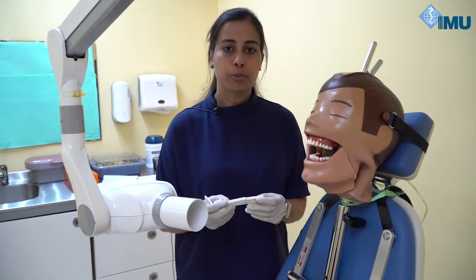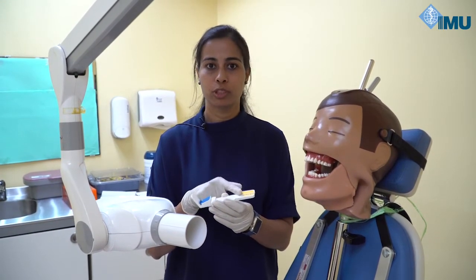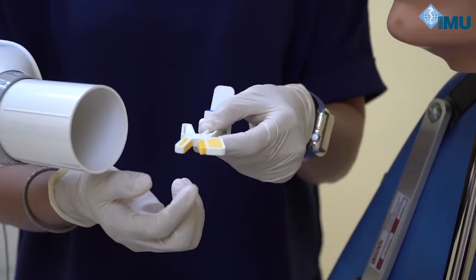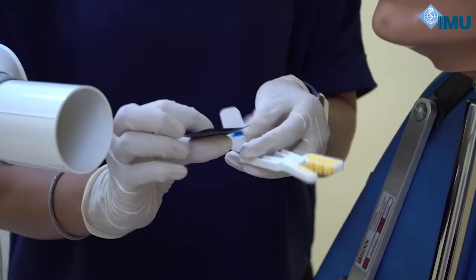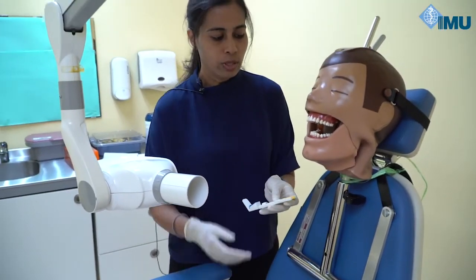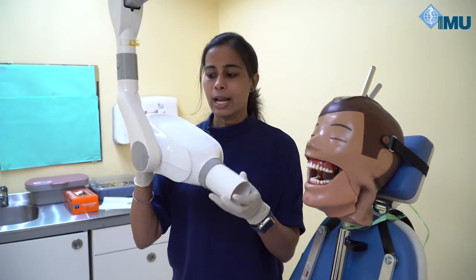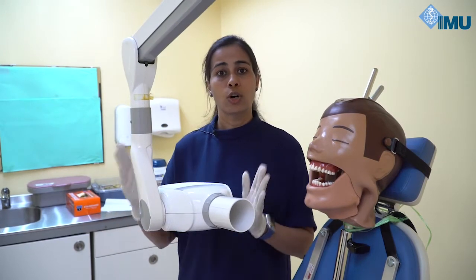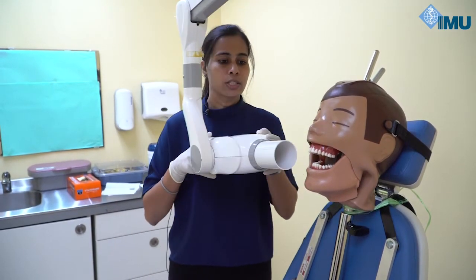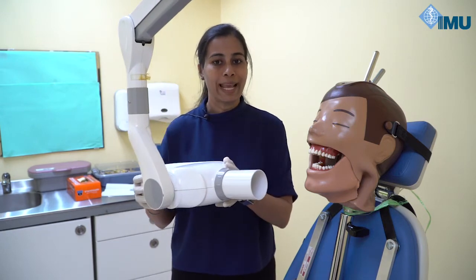For posterior bisecting technique, we use the same film holder, but the other end is used for posterior teeth. There is a broad surface and a narrow surface — the position of the film within the holder is very important. The dot on the film must always face toward the occlusal surface. For posterior teeth, we use positive vertical angulation for maxillary and negative angulation for mandibular teeth. Horizontal angulation must be zero for both anterior and posterior teeth — tilting the tube head horizontally causes overlapping in the interproximal areas.